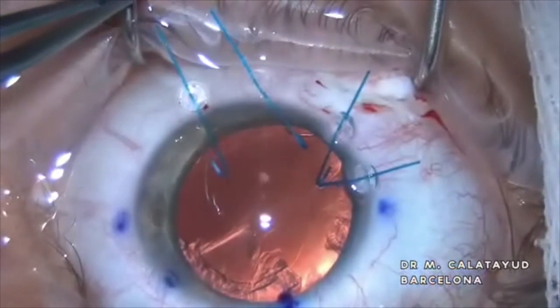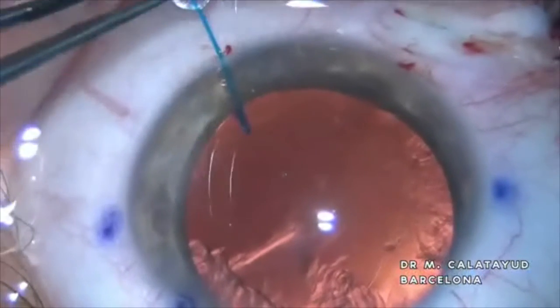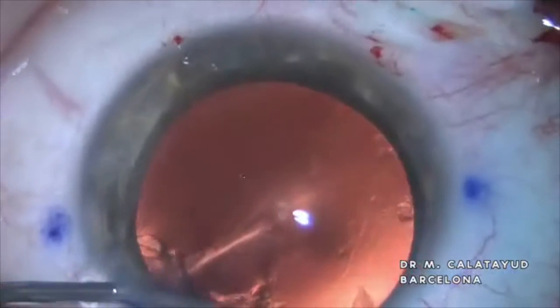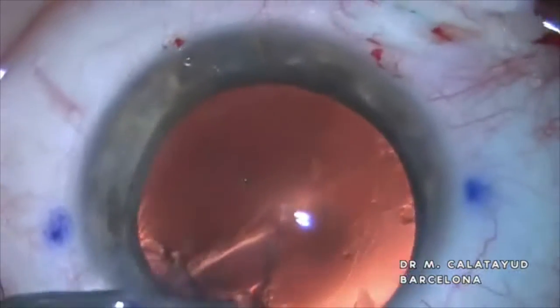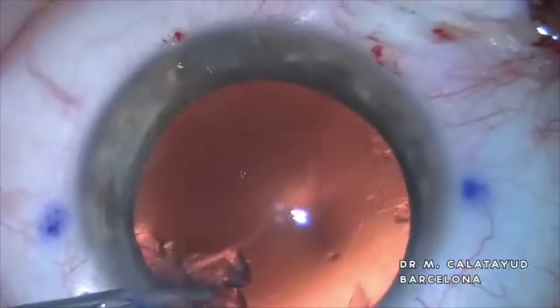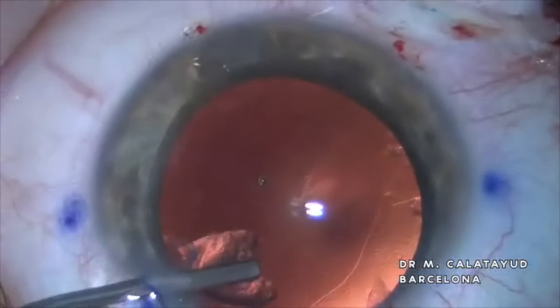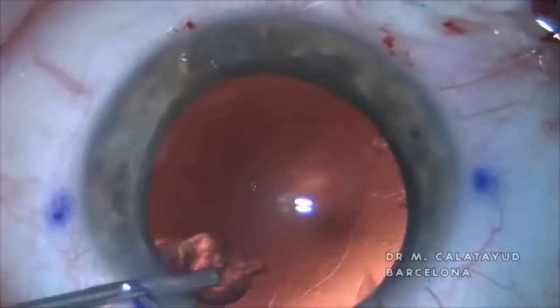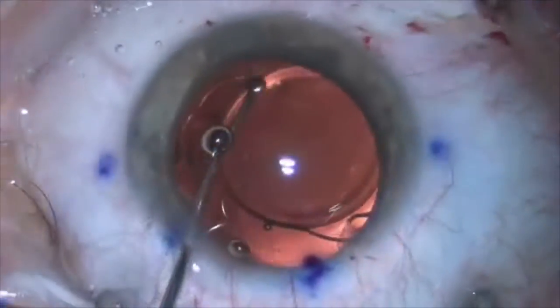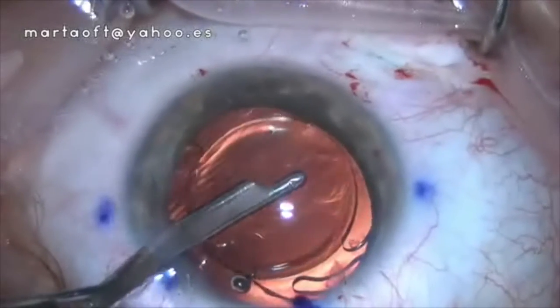Then we will be able to extract the iris hooks very carefully and eliminate any remaining crystalline material. To finish, we will implant any type of IOL we want to use in this patient. After that, we will seal the conjunctiva with fibrin and then aspirate the viscoelastic and close the surgical wounds.